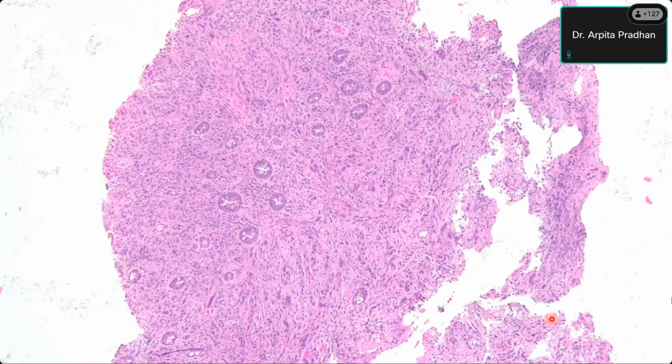We can see some glands. Very good. There are crypts of rectal glands, right? Those look normal, right? Yes, sir. Okay, then what do you see? We can see some abnormal looking cells in the scanner view, although we'll have to go to a higher power for confirmation. So you think there are abnormal cells here in between the glands, and they are infiltrating in between the glands. Yes, sir.